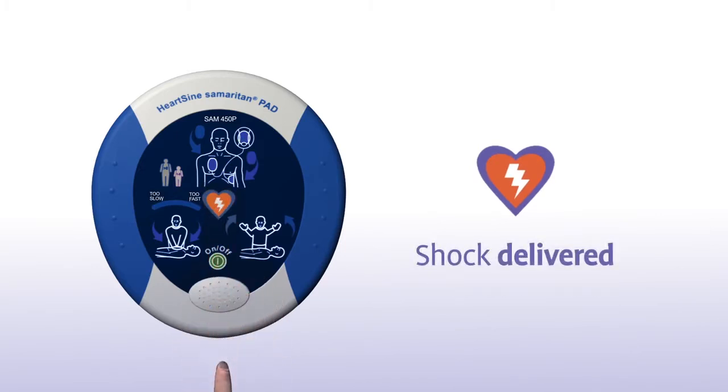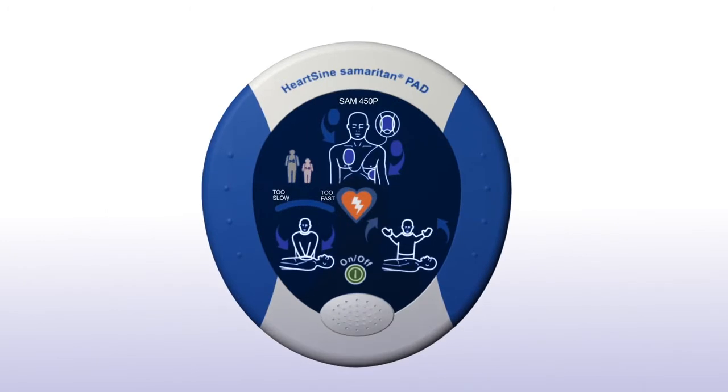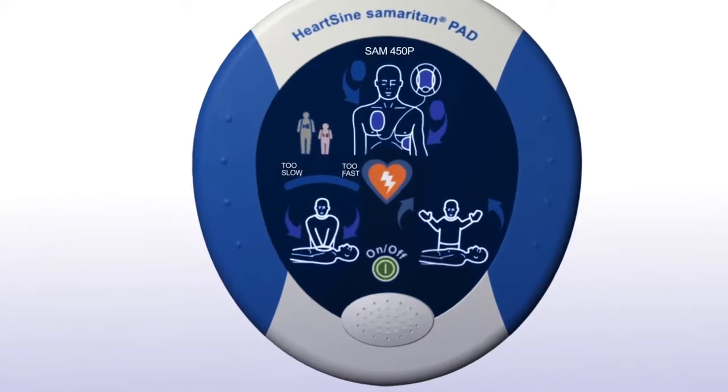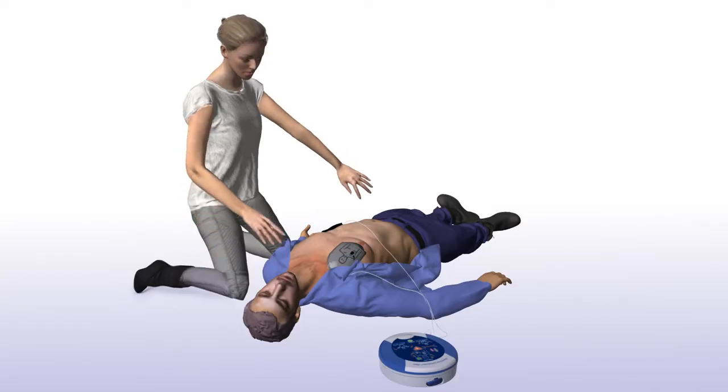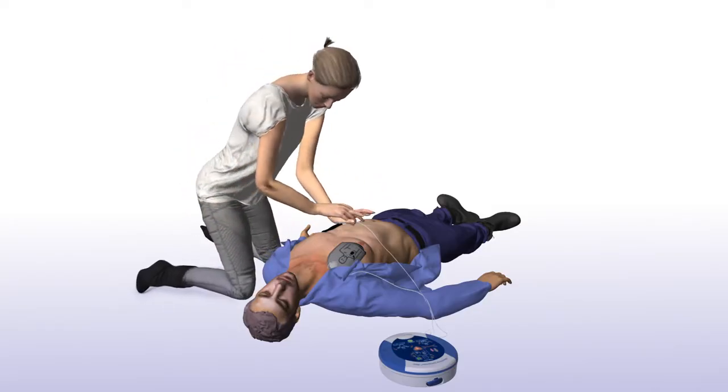Shock delivered. When performing CPR, it's important to apply effective chest compressions for each 2-minute cycle as directed. The SAM 450P with CPR Rate Advisor will prompt you to begin CPR and will continue to do so until you begin chest compressions. Begin CPR — it is safe to touch the patient.